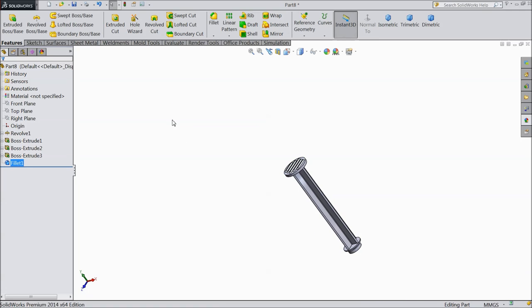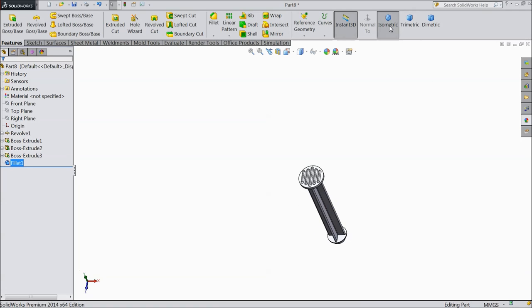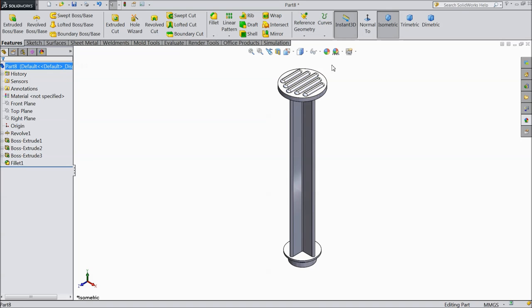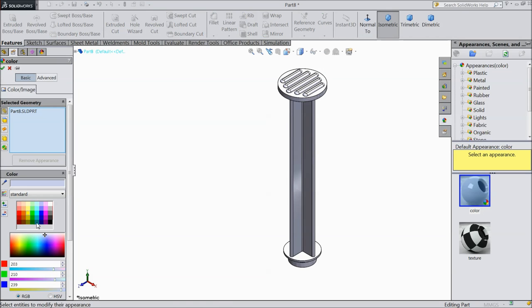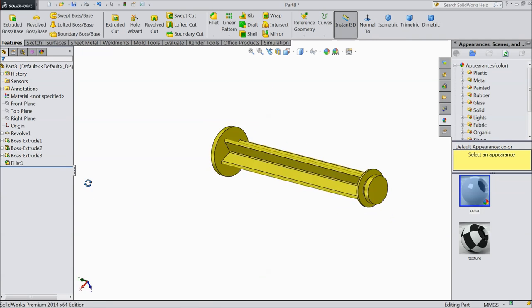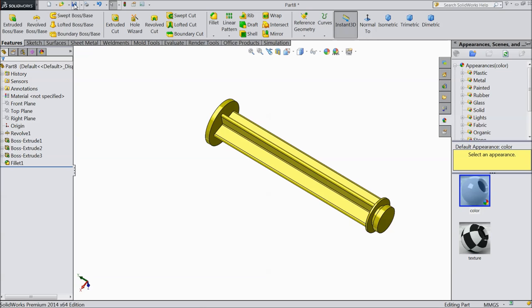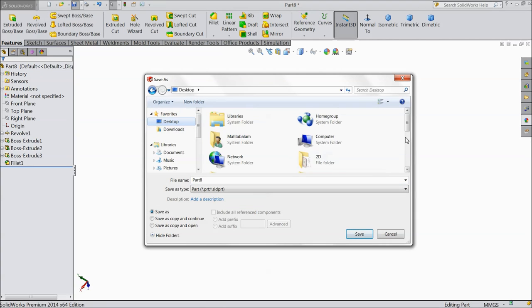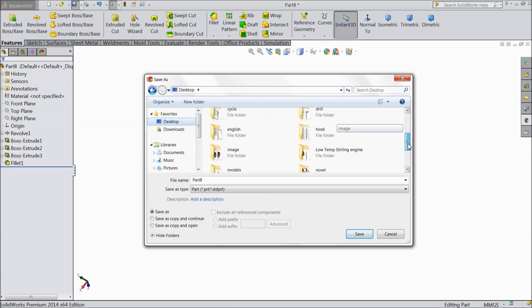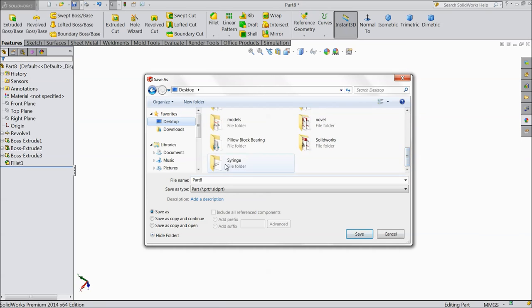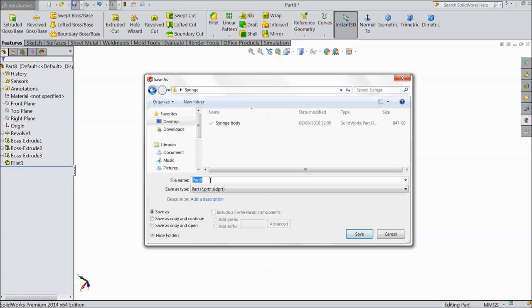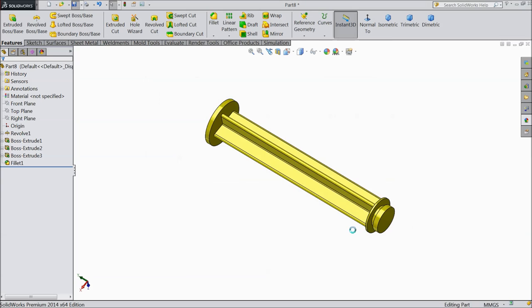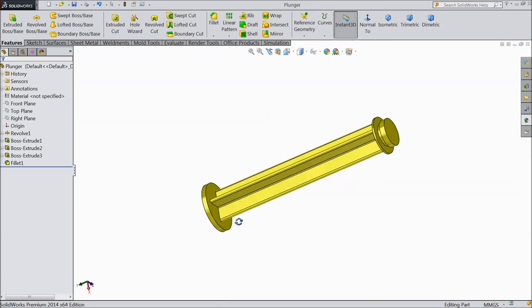Now our plunger is ready. We will assign some color to easily identify — let's say yellow color. Now save as plunger. We saved the syringe. Now let's move to the next part.